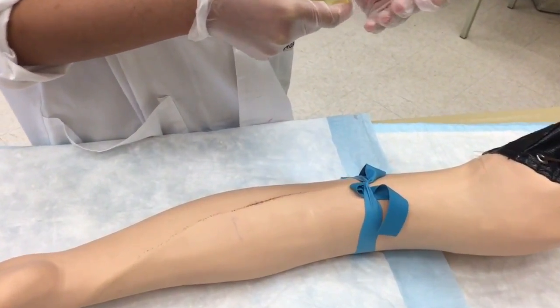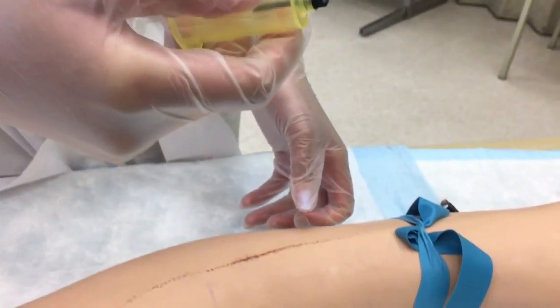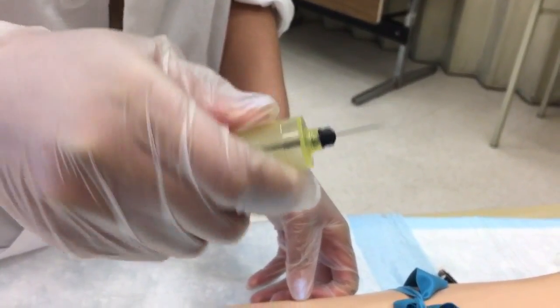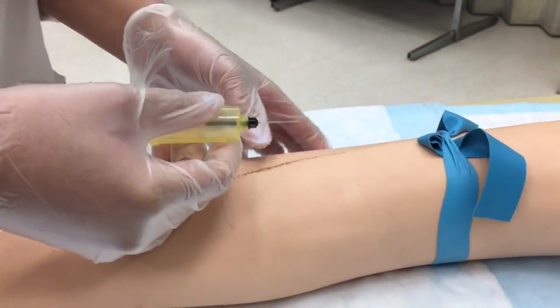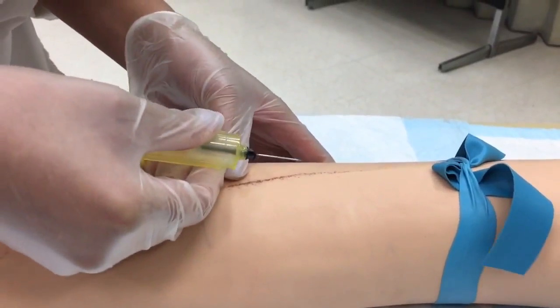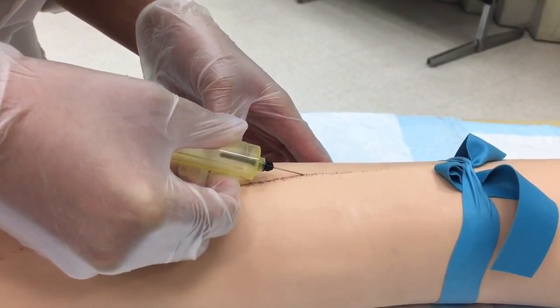I'm going to take my needle, making sure the bevel is up — because if the bevel is down, you won't get blood. The bevel has to be up. Bring the vial close by, and now I'm going to insert the needle.